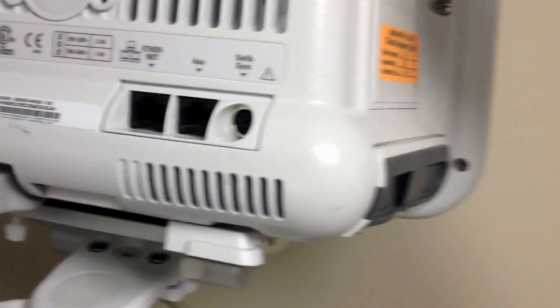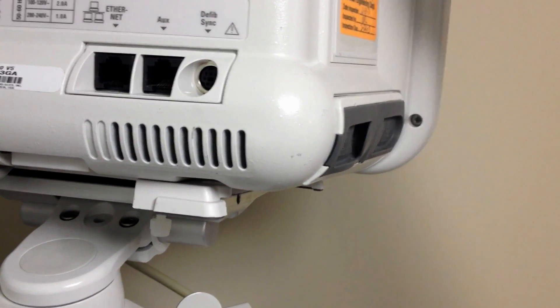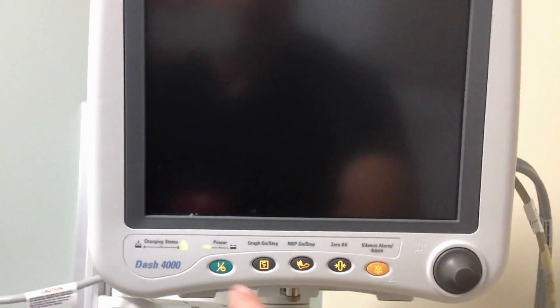GE-4000. Let's take a look at the COM ports in the back. We connect here to this COM port. It's an ethernet style jack. That's how we get our RS-232 out of it. Let's turn it on.